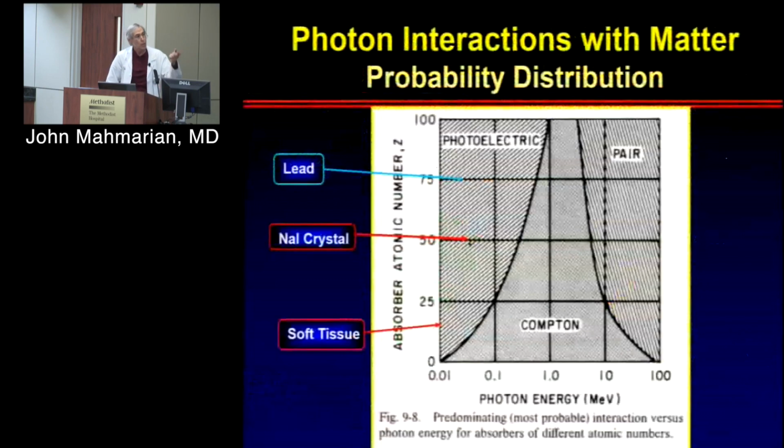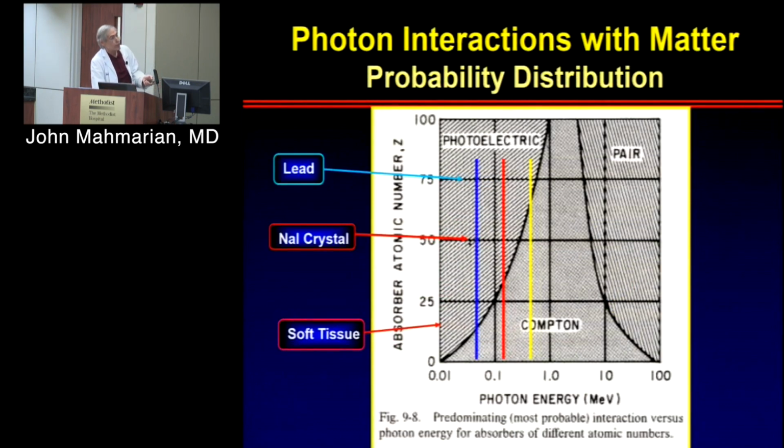The other thing to keep in mind when you think about the radiotracers that we use is where they sit in terms of photoelectric effect versus Compton scattering effect. So this is just a nice little grid. It's showing this is where Compton scattering happens. So this is in MeVs.